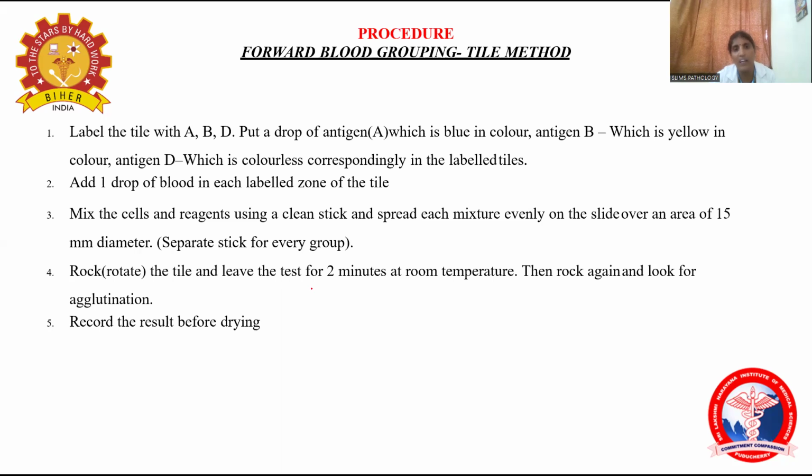What test are we exactly going to do in the practical exam? It is named forward blood grouping. To understand what you are doing, it is forward blood grouping by tile method. You all will be provided a tile, right? Label the tile number one. Yes, label the tile with A, B, D.